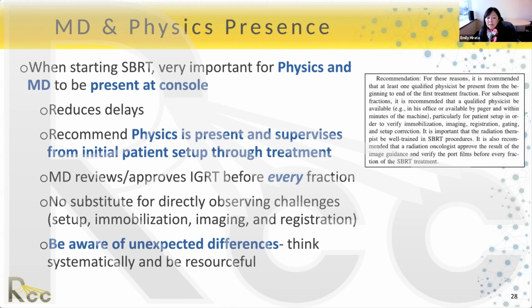And be resourceful, meaning you should be able to access the plan so that you can look at the plan and reference that. You can look at the CT scan and reference that. Certainly, call the physician and have a discussion.